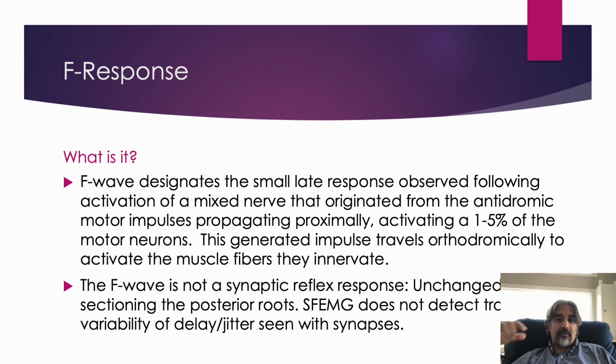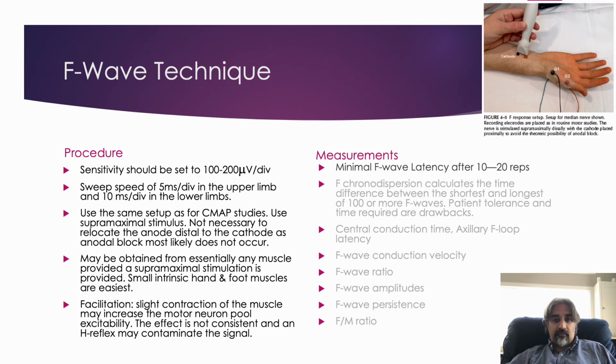It's thought to be because of some kind of backfiring that occurs. It's not very well understood. I do have a picture on that. F waves are really something that I use for someone who may have a demyelinating issue like AIDP early on, because it's checking a longer pathway. So maybe you're seeing some of the proximal segments. It's not very specific, and the sensitivity depends on what you're looking for.